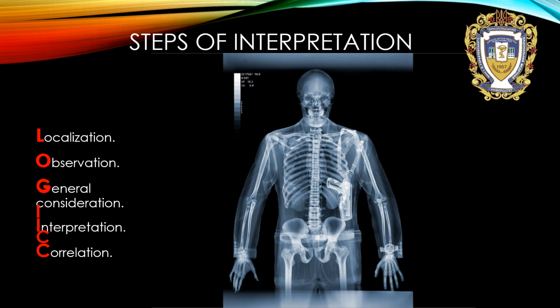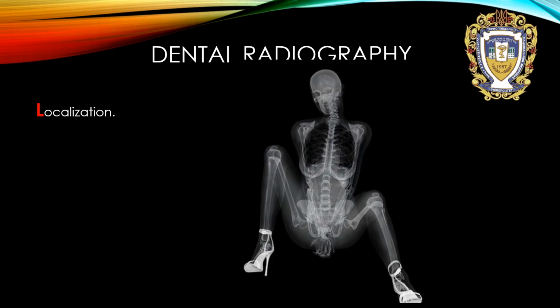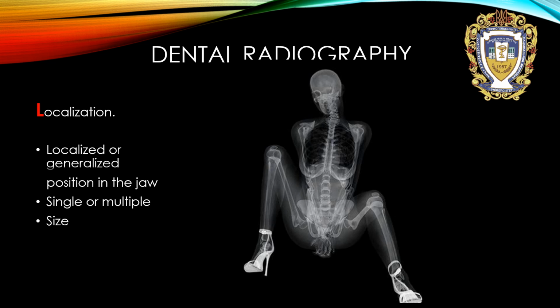During our interpretation of an X-ray, we need to describe every one of these. Localization: we need to describe whether the problem is localized or generalized, its position in the jaw, single or multiple, and the size of the pathology.